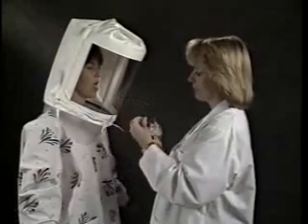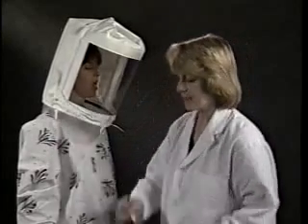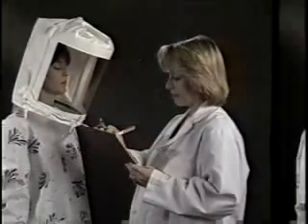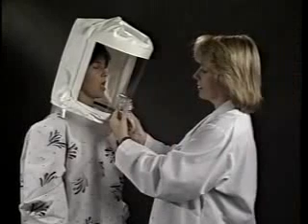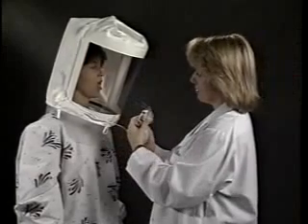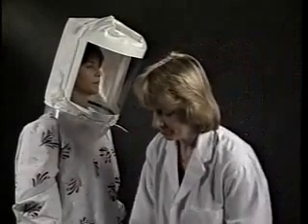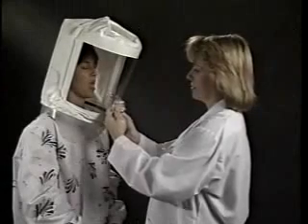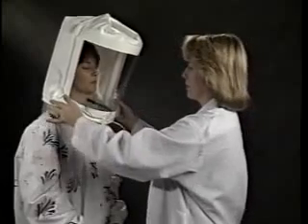Ask the test subject if they can detect the sweet taste of the solution. If they can taste the solution, then note the number of squeezes as 10 and proceed to the fit test. If not tasted, inject an additional 10 squeezes of the aerosol into the hood. Repeat with 10 additional squeezes if necessary. Note whether 20 or 30 squeezes produce a taste response. If 30 squeezes do not produce a taste response, end the test. Another fit test method must be used for that individual.